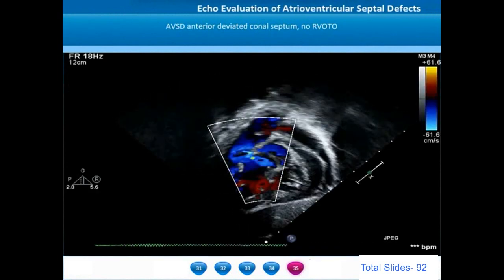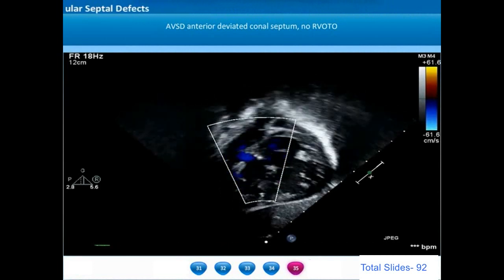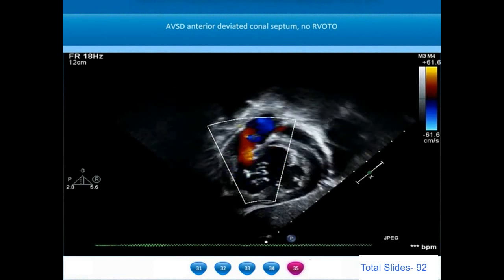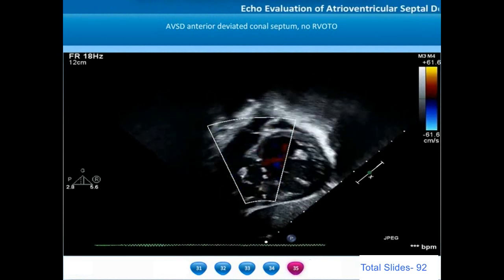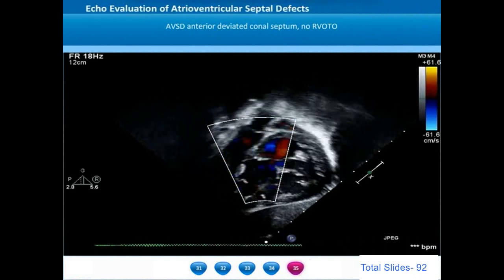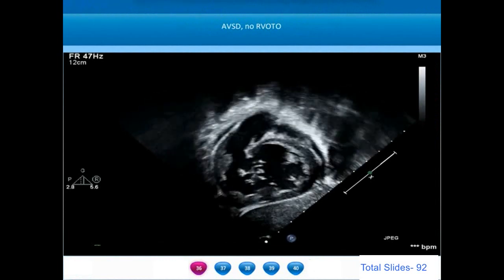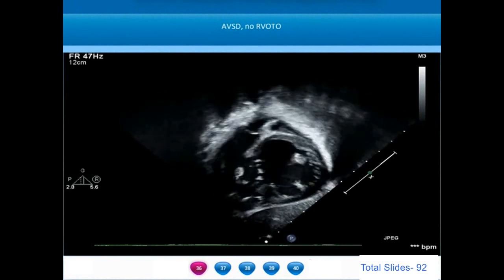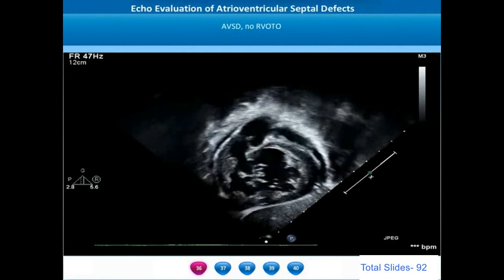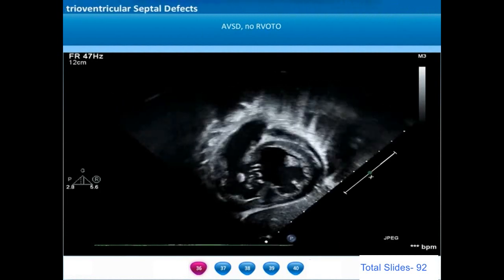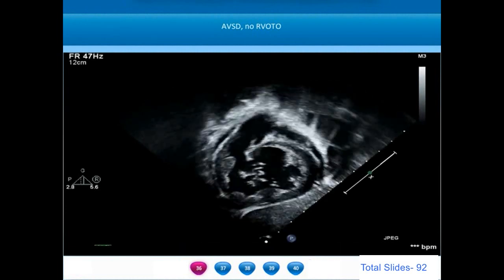This is another example of a Rastelli type C AV septal defect where the bridging leaflet cordae have no attachment towards the interventricular septum. There is also anterior malalignment of the conal septum; however, the anterior deviation is not severe enough to cause substantial right ventricular outflow tract obstruction. Rastelli type C AV septal defects are commonly seen in patients with associated tetralogy of Fallot, double outlet right ventricle, heterotaxy syndromes, or single ventricular situations.